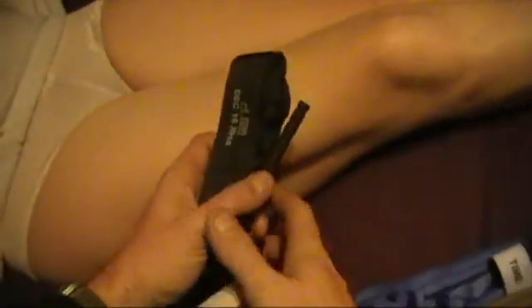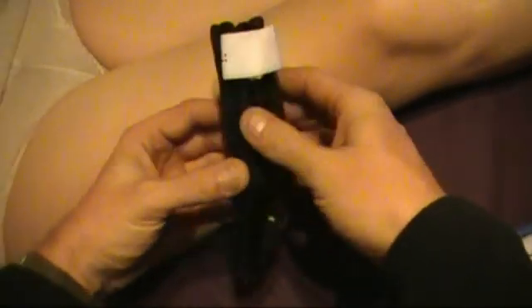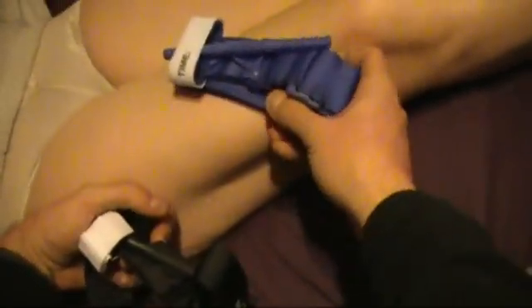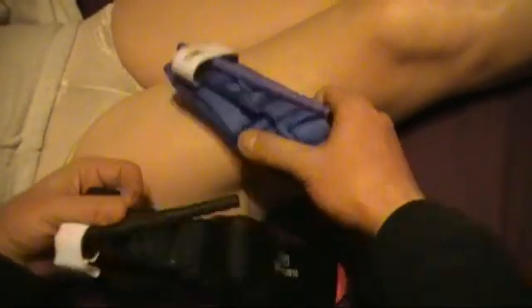First things first, let me show you the tourniquets. These are actual issue tourniquets. This is a CAT tourniquet from North American Rescue. Self-contained. The black one is for actual use. The blue one that we have here is for training, and we'll be using it because it better matches the skin tone of my patient. The blue, black, blue.